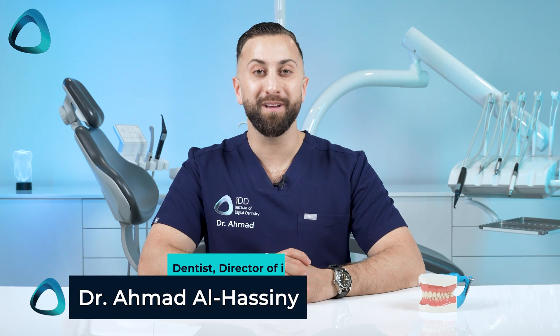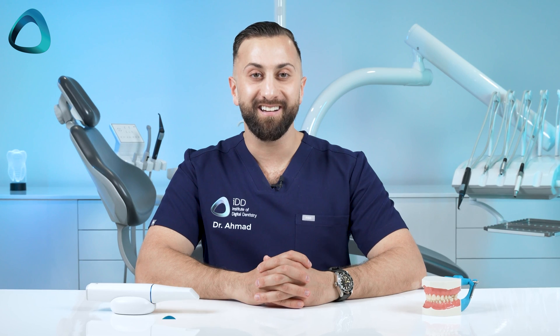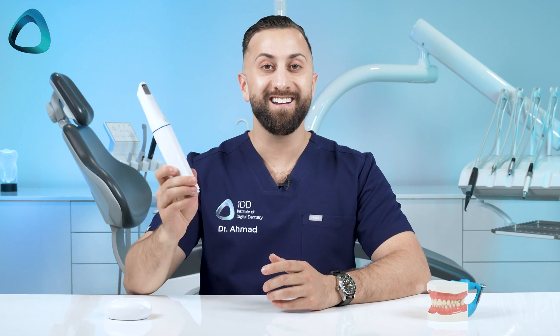Hey everyone, Dr. Amit Al-Hasni here from the Institute of Digital Dentistry, and I'm super excited to introduce to you the latest and flagship scanner from Medit, the Medit i900.